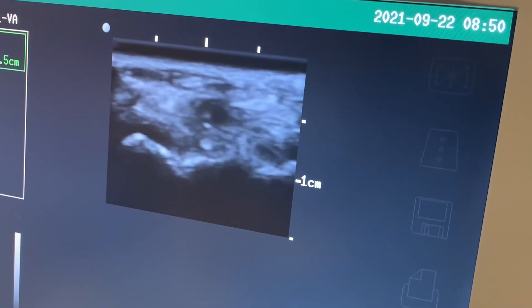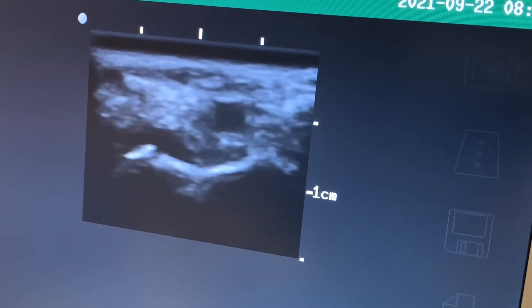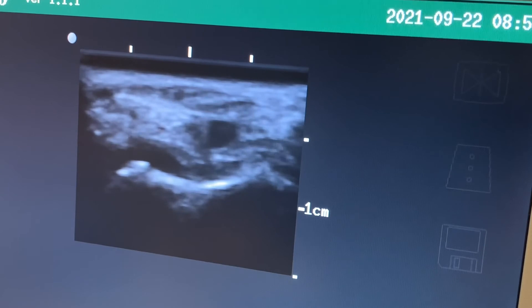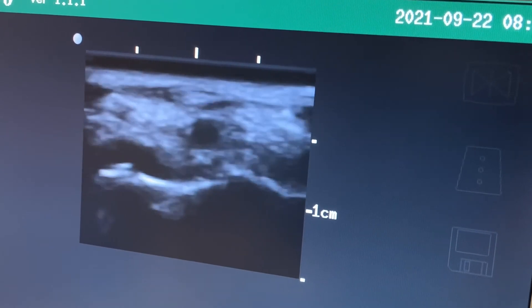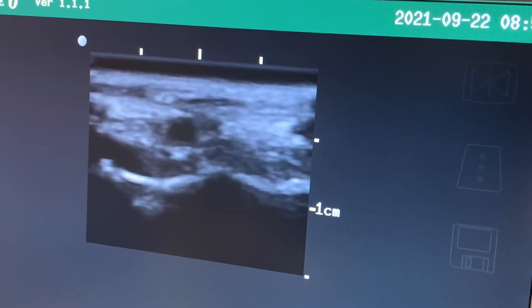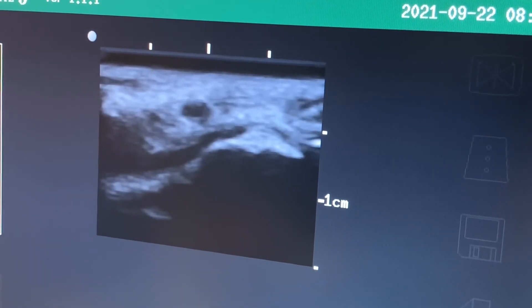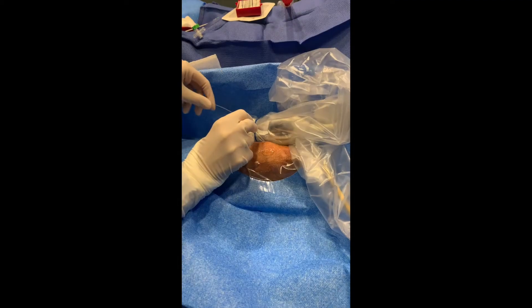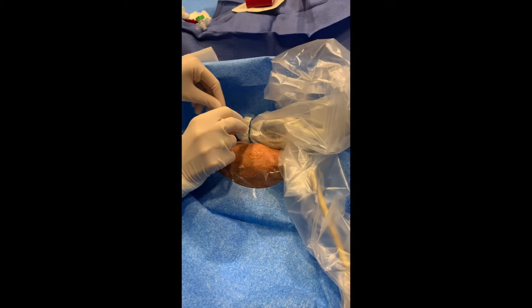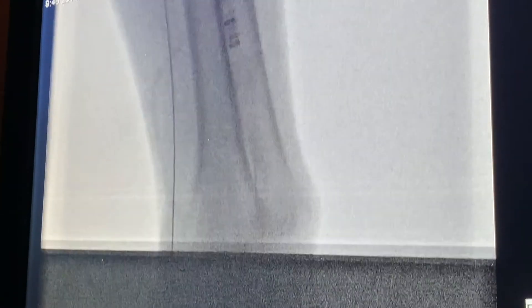Here we are attempting access, and you can see that our fellow is directing the needle towards the center of the distal radial artery. This is the first time our fellow is attempting this procedure, and they are doing a great job. Once Seldinger technique access has been obtained, the micro wire is able to be advanced quite smoothly, and it can be confirmed via fluoroscopy as you can see here.